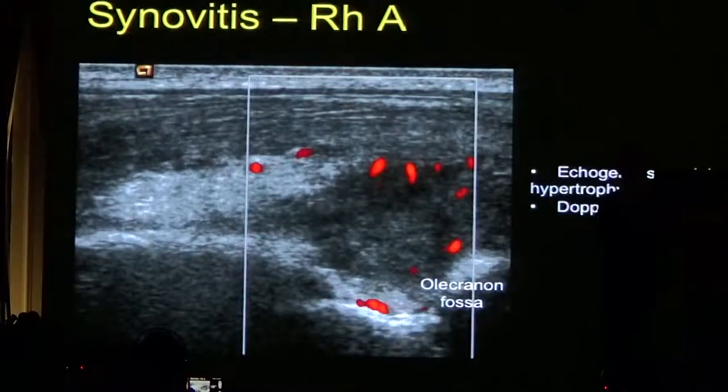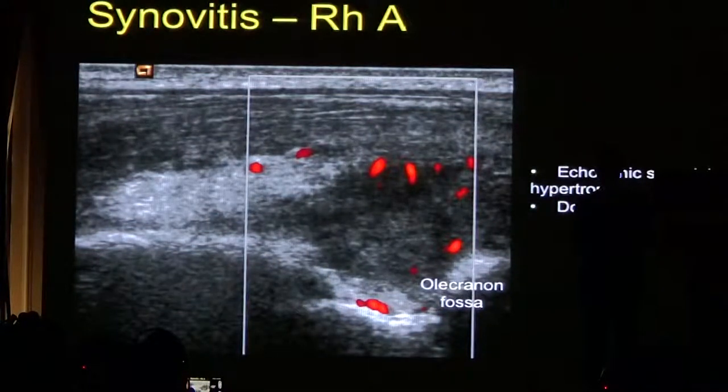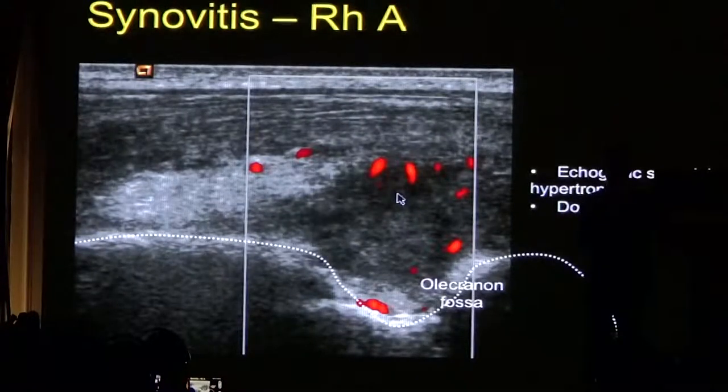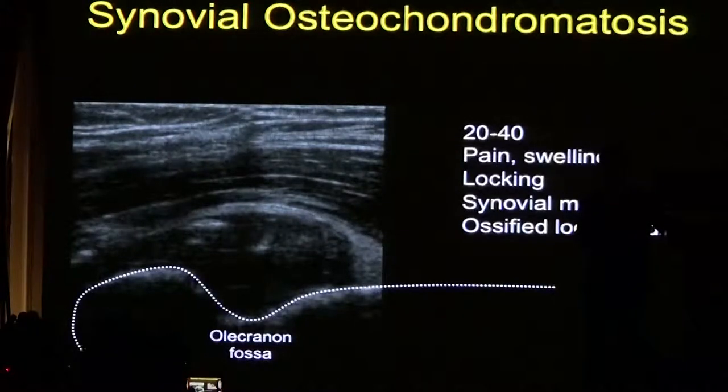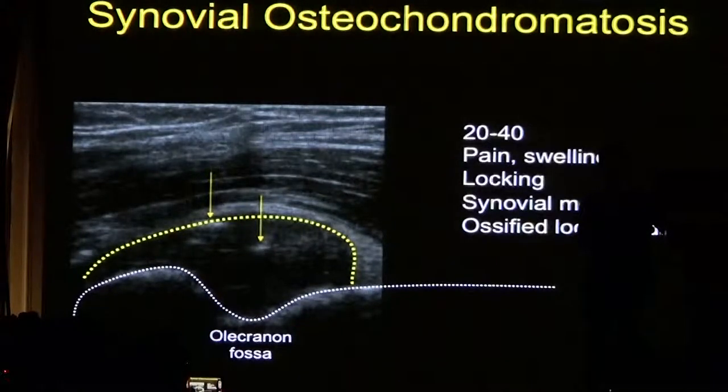This is an example of synovitis in the olecranon fossa — you can see echogenic material within the elbow with increased vascularity. If you put a needle into this, you're unlikely to be able to draw off any fluid. This is an example of synovial osteochondromatosis, where patients have thickening of the synovium and form loose bodies within the joint. You can see the olecranon fossa with echogenic loose bodies lying posteriorly within the extended joint.